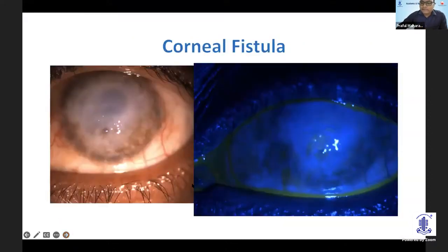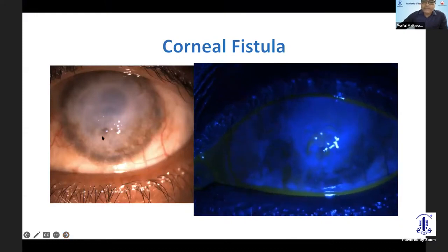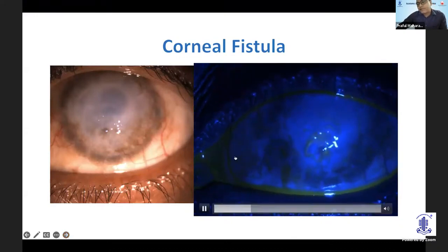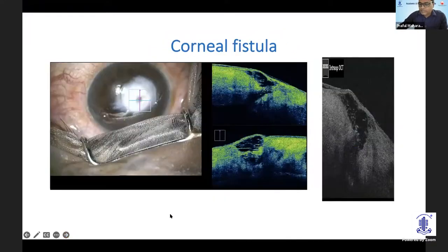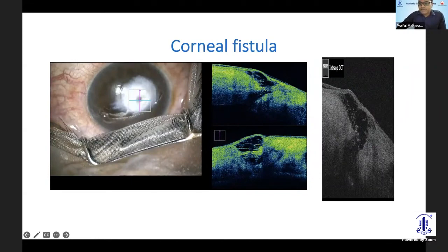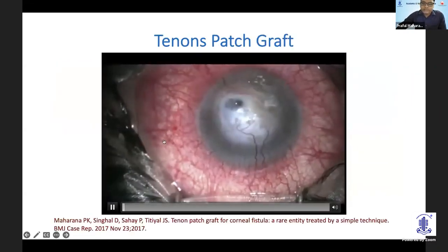Corneal fistula — as you can see on the left, although it appears apparently healed, when you stain it you will see there are some leaks. This is a microscope OCT picture. You can see there is a track which is epithelialized, but still there is a communication to the anterior chamber. This is a video of such cases, normally done in emergency.